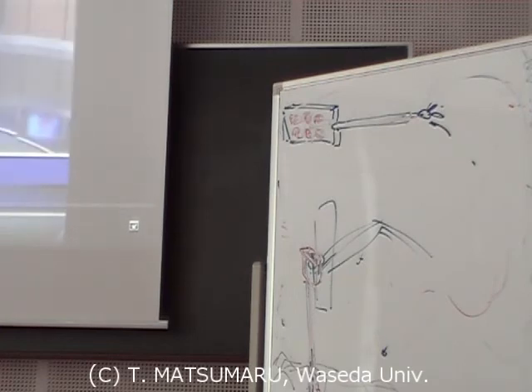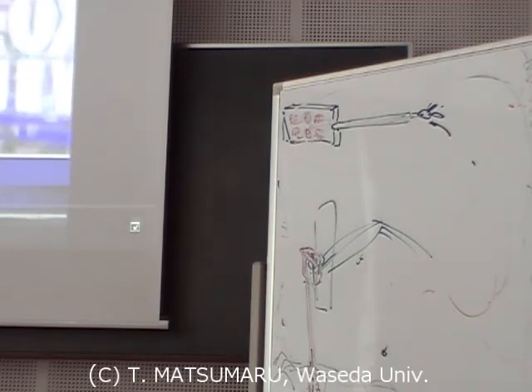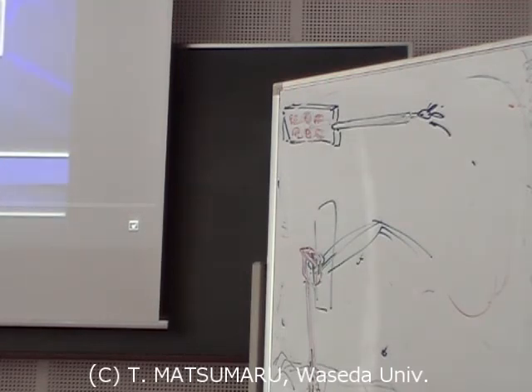What is the concern or the problem specifically with the Da Vinci robot? So this robot, the technology has been around for now 12 years, and hundreds of thousands of these cases have been done. Like any other technology, if you have experienced surgeons plus the technology, you're going to have good results and good outcome. If you have inexperienced surgeons who are not well trained and you give them this technology, you're going to have a bad outcome. I think that's where we are with this.